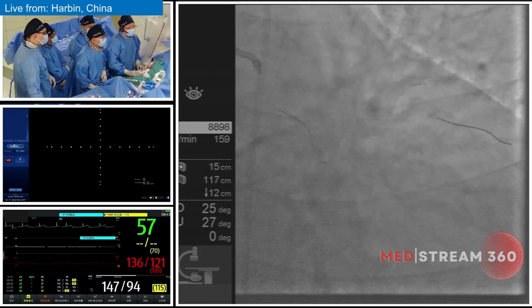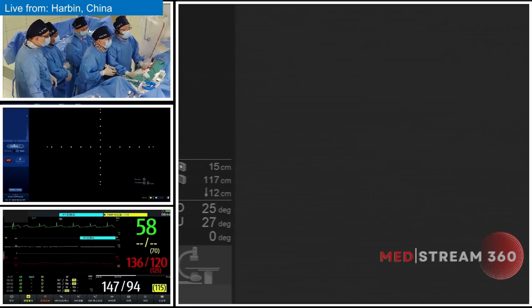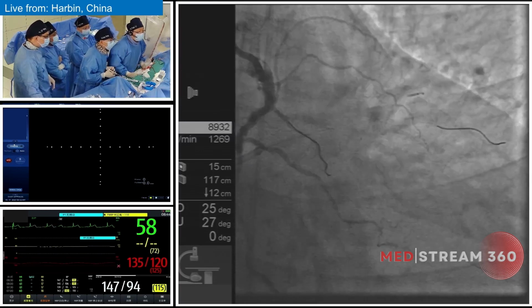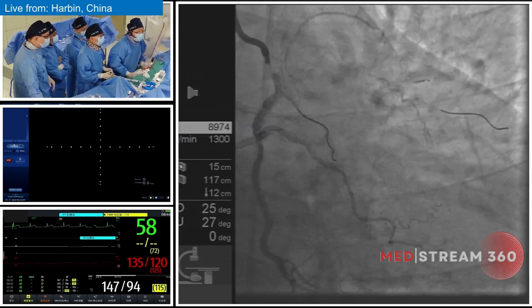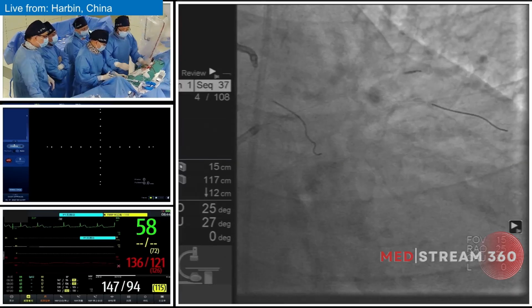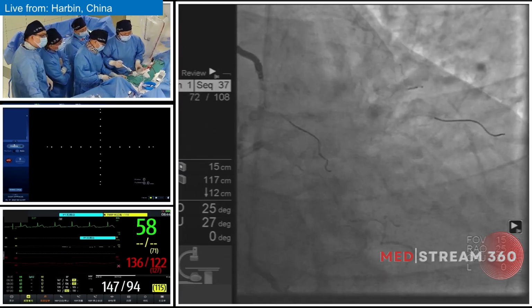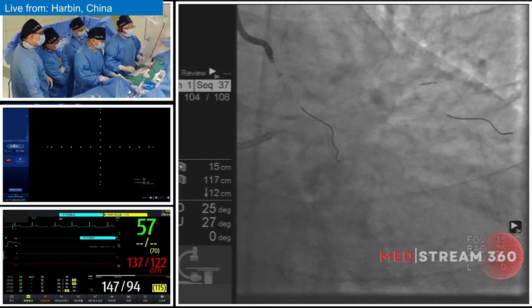Okay, that's fine. The bilateral sides of the Stingray balloon coexist in one line, which means the whole balloon is in a horizontal situation, making it relatively easy to identify the puncture direction, which hole we are crossing, and which direction we are trying to go.